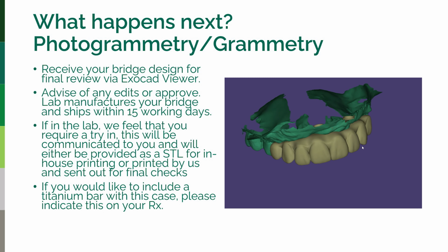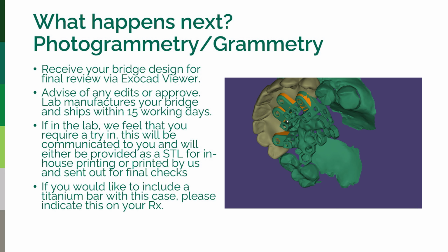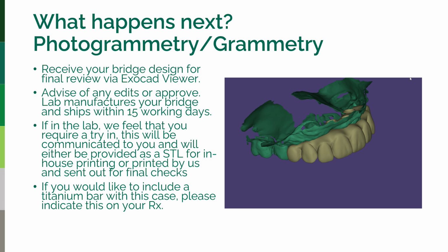What you're really looking to do here is to ensure that you're happy with the bridge. At this point, the lab can advise you if they believe there are any particular issues, if they feel it is required. But in many instances, if the records have been good and you've followed those 6 scans and 6 photographs, the lab would be happy to go to final restoration.